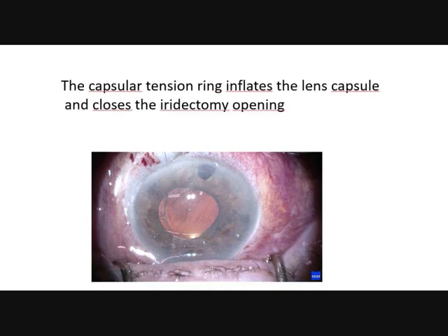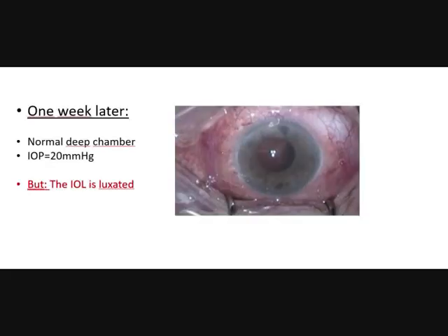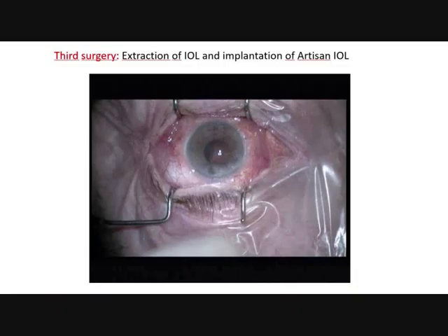Because the capsular tension ring inflates the lens capsule and the lens capsule is behind the iridectomy opening. So this is not patent. So I decided to do a lens capsulotomy simply to open the lens capsule behind the iris. 1 week later, normal deep chamber, normal IOP, but the IOL luxated. What would you do now? Well, I extracted the IOL, implanted an Artisan IOL.